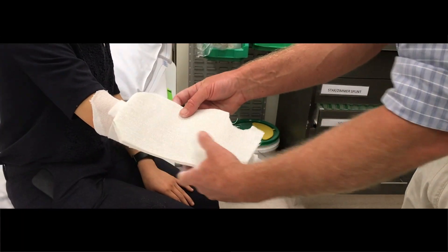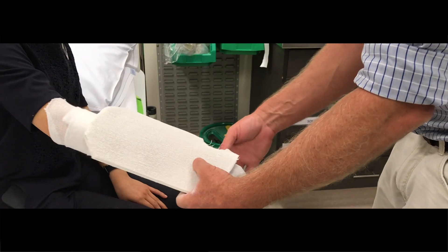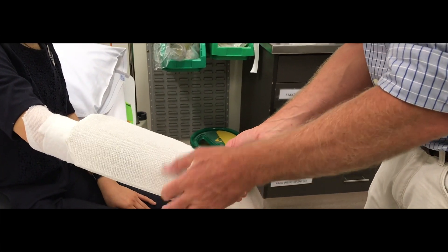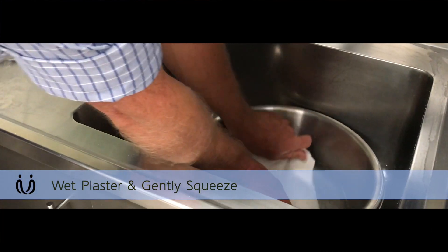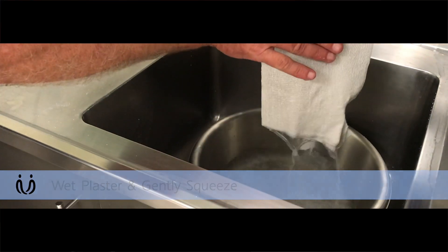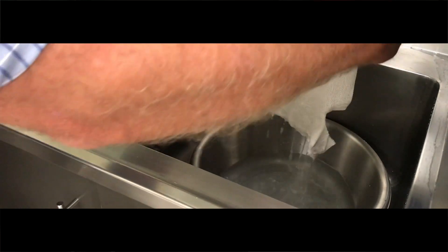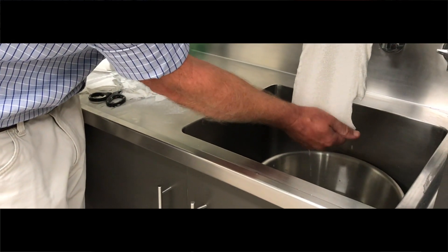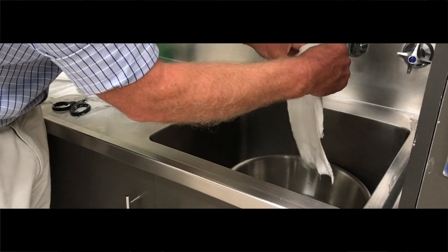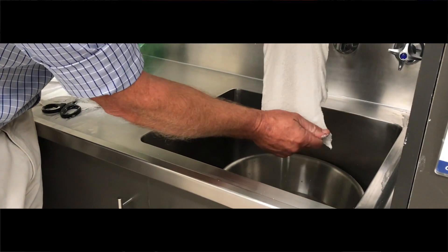That's going to go as a backslab like that, and that's going to go where your thumb is, and this is going to wrap around in there. You just dip that in the water — and that's wet through. Then just give it a gentle squeeze. Don't squeeze it too much or all the plaster will come out. You don't want it so it's runny and soaked. And there's your plaster.